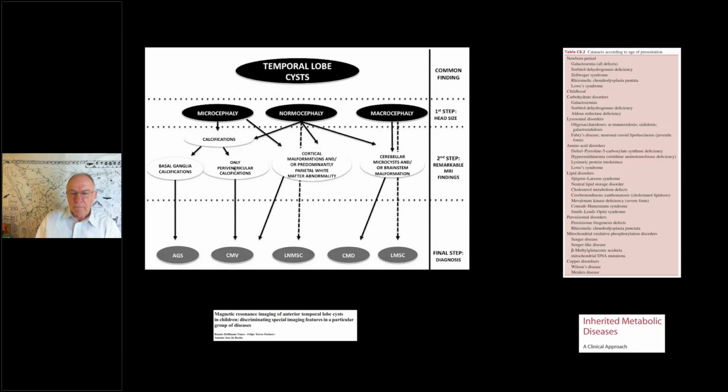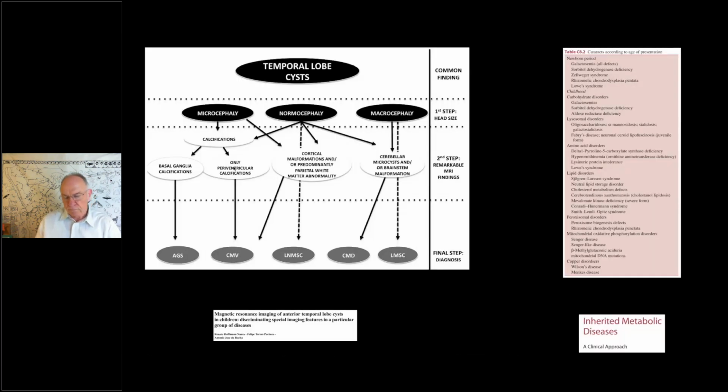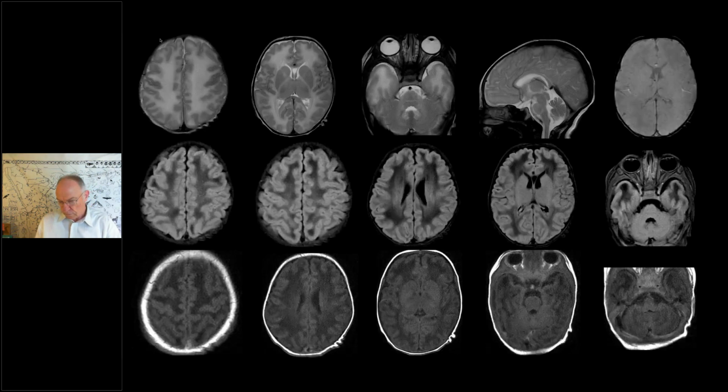Thanks, that was very useful. So there are no further comments. Just wanted to ask, is there hypomyelination as well? Because the patient is a 2.5 month old. I would say, yeah, there is some degree of delayed myelination. It could be, right. But if I refer to the periventricular subcortical white matter, it demonstrates these rarefactive changes. It is not typical for a hypomyelinating pattern. Right. Thank you. Okay.